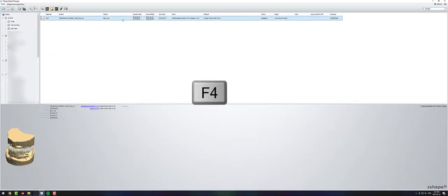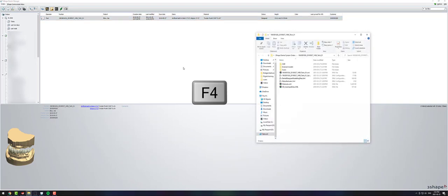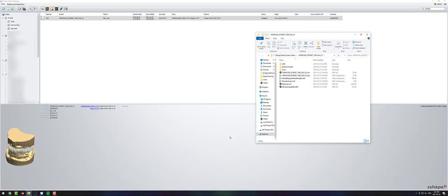If you highlight a case, you can also click F4 and this will bring up the 3Shape order for this specific case.